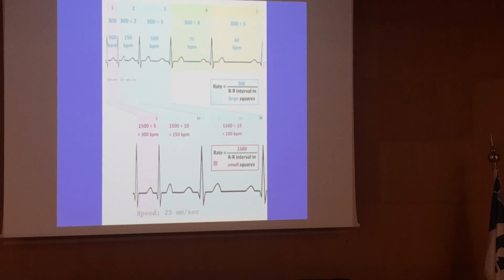Irregular? For irregular heart rate or for regular? For irregular. For irregular, we know that RR is changing. So it could be short then long, short then long. If I take this R to R, for example, the rate is 100. And the other R to R, the rate is 60. So what is the rate? Is it 60 or 100? If I take also these 2 beats, it's different from the other few beats.